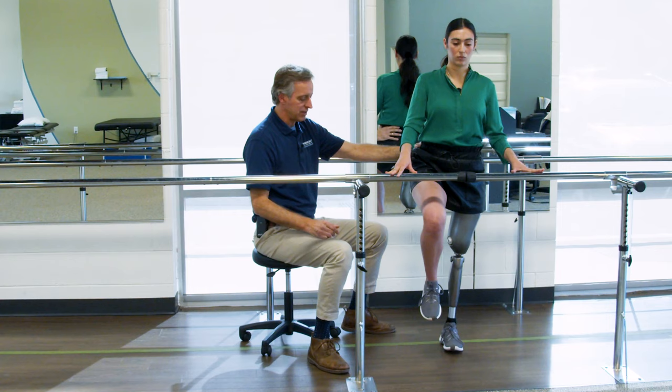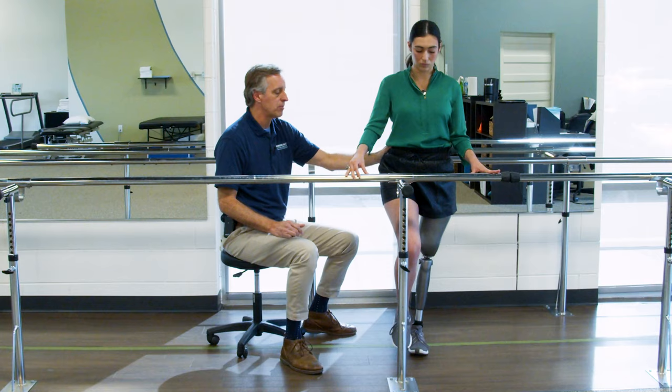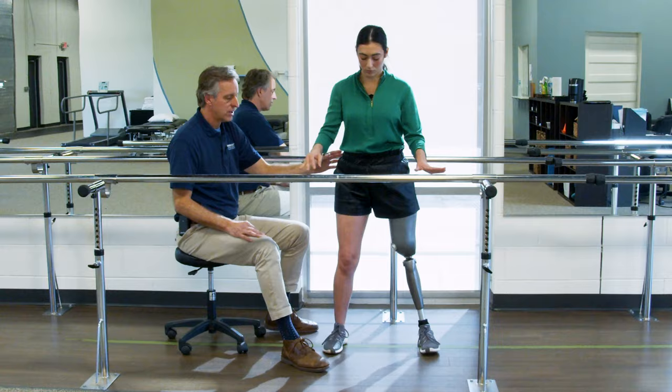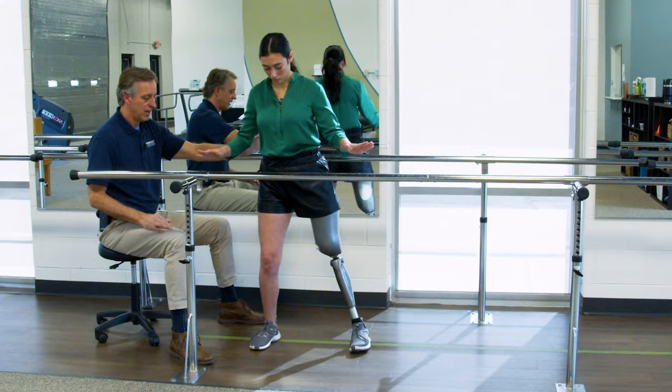Now all I'm doing here, again, hand at her pelvic level, is keeping her pushed a little bit more towards the prosthetic device, a little more on it than she wants to be, to make sure she's really got it loaded. As she's doing better and saying, okay, I got the feel for this, then I want you to try taking your hands off and hover the hands and see if you can do the same thing. Slow it down, hold. There you go, slow it down, hold. Good, slow it down, hold.